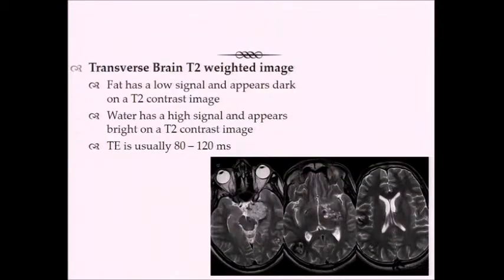So as I said, again, here is our subcutaneous fat. And what I'm really saying is that the signal is not a complete dark signal because we've only weighted our scan. We still have some influences from just proton density. So there is signal there, it's just not as bright as the signal we see in water.